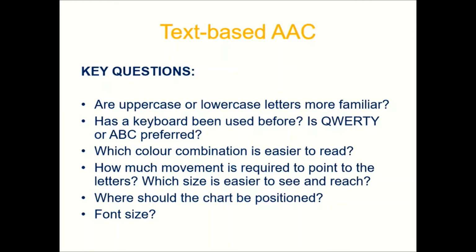So let's start with text-based AAC. Let's say you've established that your client is literate and can spell and read very proficiently. Some additional things you'll need to think about is casing. So are uppercase or lowercase letters more familiar? Do they have any visual difficulty that's going to make lowercase letters more difficult for them to identify? Have they used a keyboard before? Are they very used to a laptop keyboard layout, such as a QWERTY? Or do you think they're going to prefer an A, B, C, D alphabetical layout? Is there a color combination that they find easier to read with?